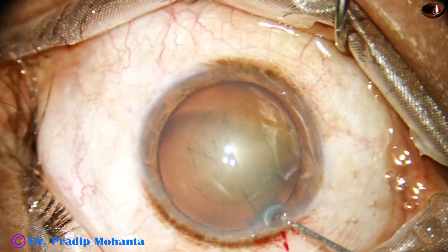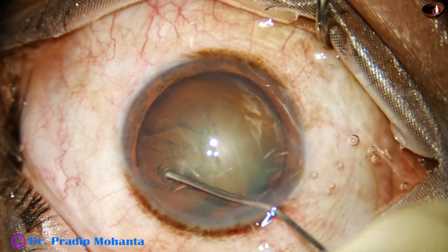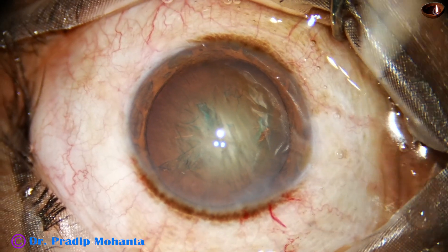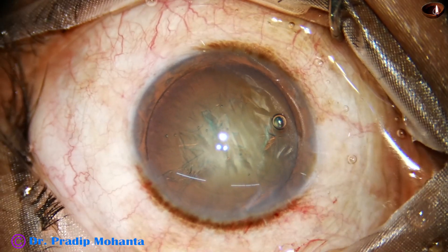It's fairly round and central. Hydrodissection is done with BSS. The anterior chamber is again filled up with HPMC.